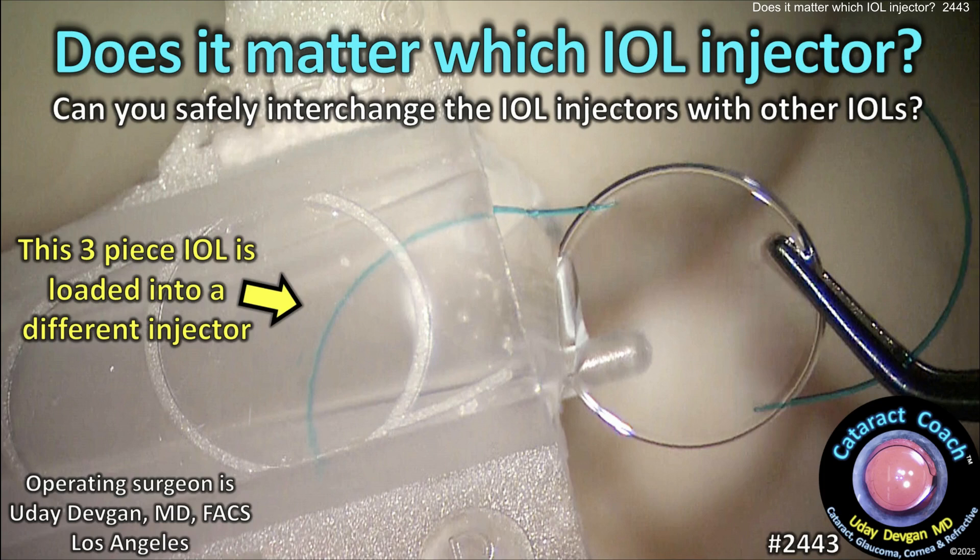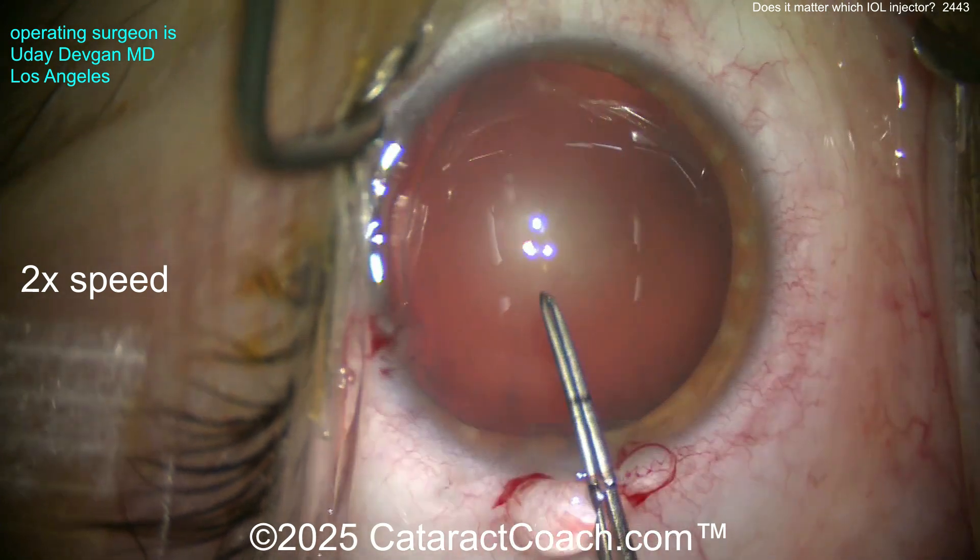From cataractcoach.com: does it matter which IOL injector you use? Can you safely interchange injectors with other IOLs? Let's watch this case.